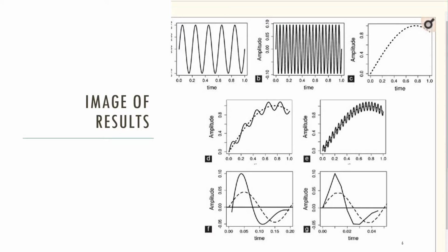I thought I'd offer you a graphical display of what the test looks like. Basically, you could see the oscillating waves superimposed on the graphics that normally come from spirometry. And these tell a lot more information than normal spirometry. You could see the superimposed waves on top of it, and they do some calculations on this where they can make interpretations of small versus large airways, and it's a really good test. We'll get more into this a little bit later.